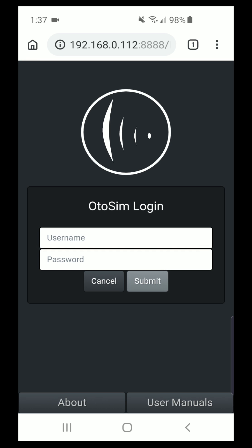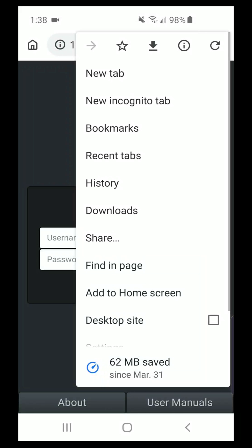That will create the logon screen, where you would have been given your username and password for a personalized login. But before we do that, we're going to create a home screen icon in order to eliminate the navigation bar at the top. You would create a homepage icon either on an Android or an iPhone. In this case, this is an Android platform, so we will bring down our drop-down list to add this site to the home screen.